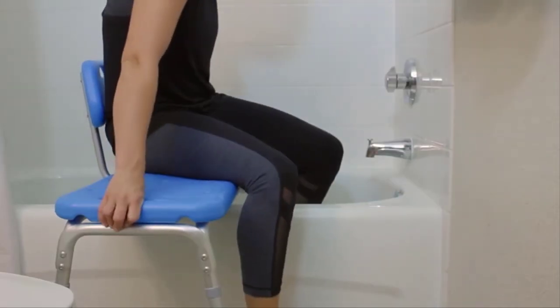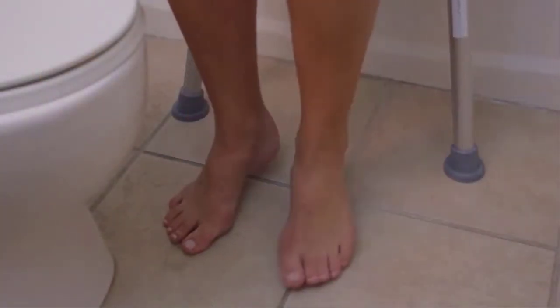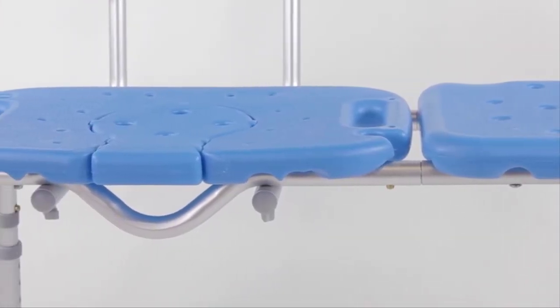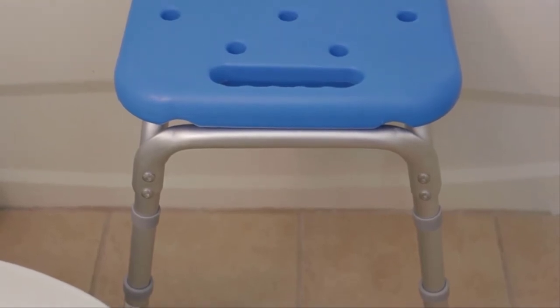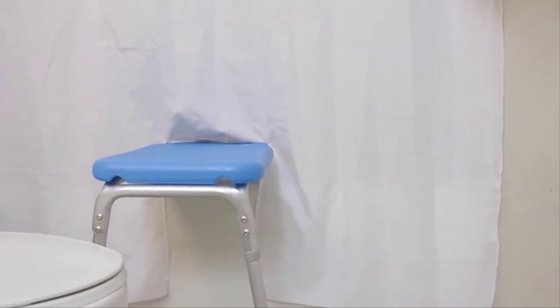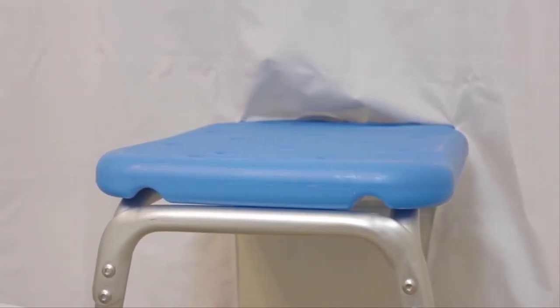Once bathing is complete, bathers can exit the tub with their feet firmly positioned on a safe, dry surface. The rugged, stable, medical-grade aluminum frame will never rust and all surfaces are easy to clean and disinfect. In order to integrate with extra-high tubs, optional vertical extension kits are available. For bathtub installations, we recommend incorporating the split shower curtain option to help keep water off the bathroom floor.